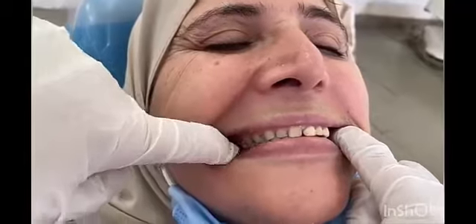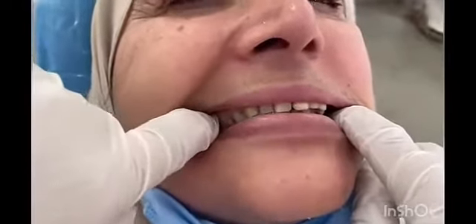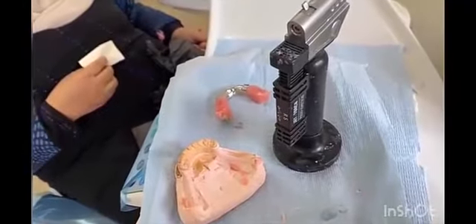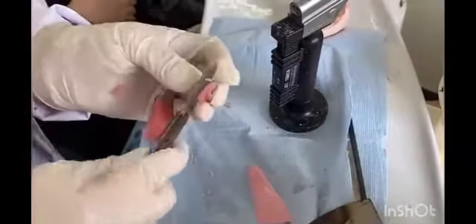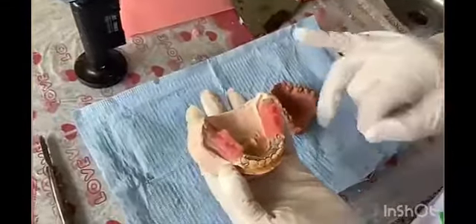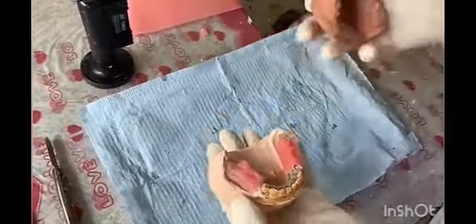ملاحظ إن فيه space بين الupper molar وبين الlower wax، معنى كده إن الwax في الجزء ده low، والmolar ما عملش contact بالwax، فما سجلش occlusal relation في الجزء اللي وراه. هطلع الmetal framework من بق الpatient وهضيف layer من الwax في الجزء ده بتاع الwax rim بحيث أعالي الlevel بتاعه شوية.